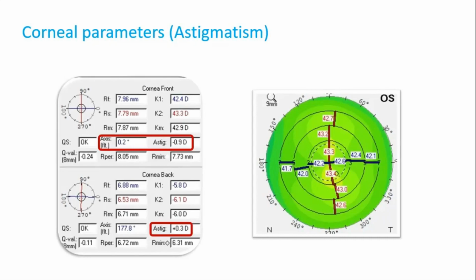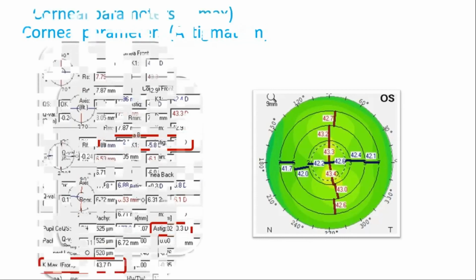So whenever we have cases of keratoconus, we'll try to see how the posterior corneal astigmatism behaves in future. We don't normally pay attention to it, but maybe we can, to see if there's a pattern, especially in forme fruste keratoconus. For example, today we had a patient whose one eye had high astigmatism and the other one had FFKC. We could look at that patient's posterior corneal astigmatism and see if it changes. So let's go ahead.